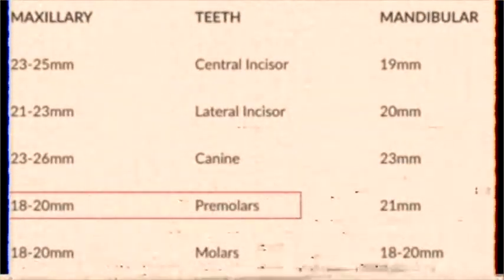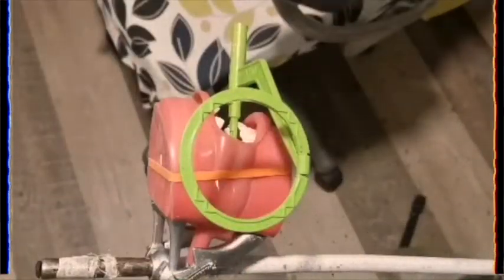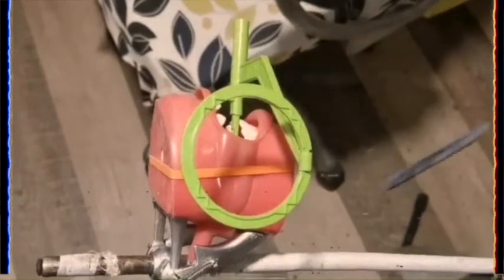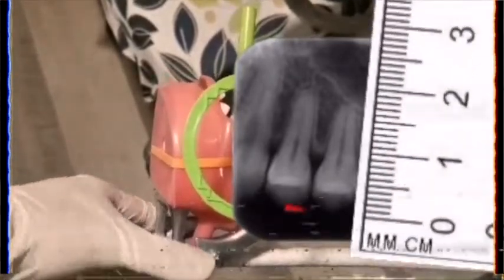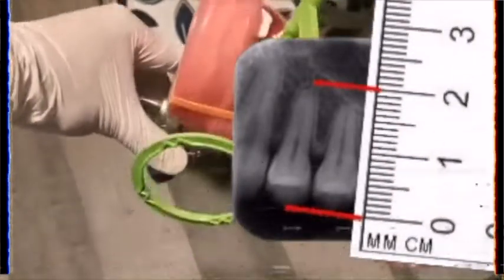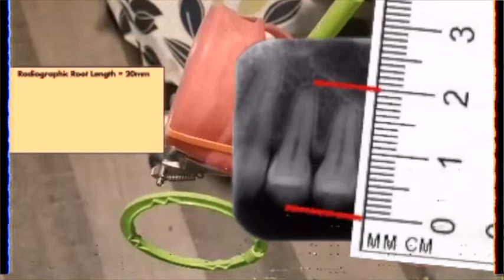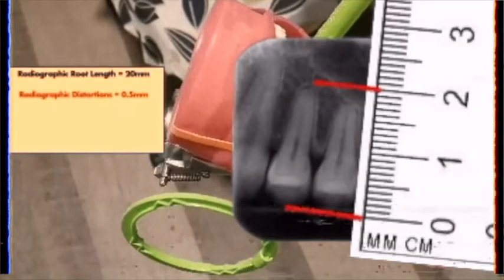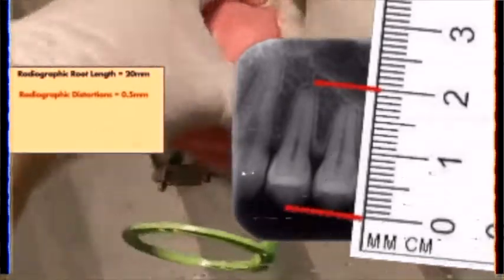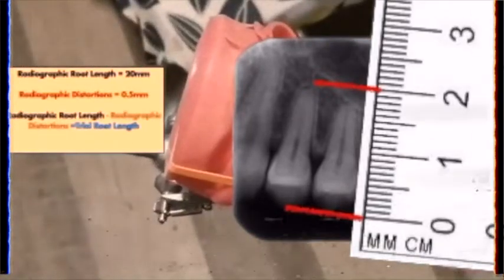Working length determination. First, we memorize the ideal length of each tooth. Then, we take a radiograph to check our radiographic root length. Now, according to our measurements, you can see that our radiographic root length is approximately around 20 millimeters. Now, to account for the radiographic distortions, we subtract 0.5 millimeters. We do a little and simple subtraction and we will come up with a result of 19.5 millimeters.